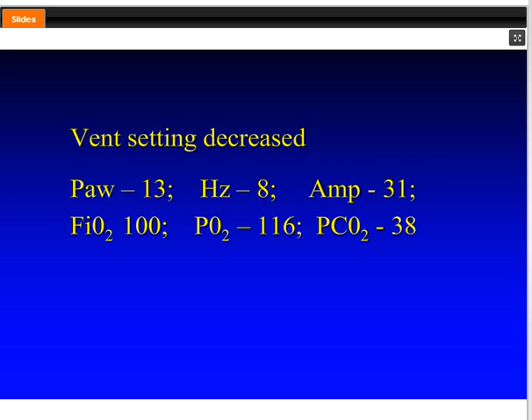So somebody looked at that x-ray and said, whoa, this baby's too inflated. That right lung is more than 9, 9.5 ribs, so they turned the mean airway pressure down. And noticed that the baby wasn't quite as good, but really didn't get very sick at that moment in time.